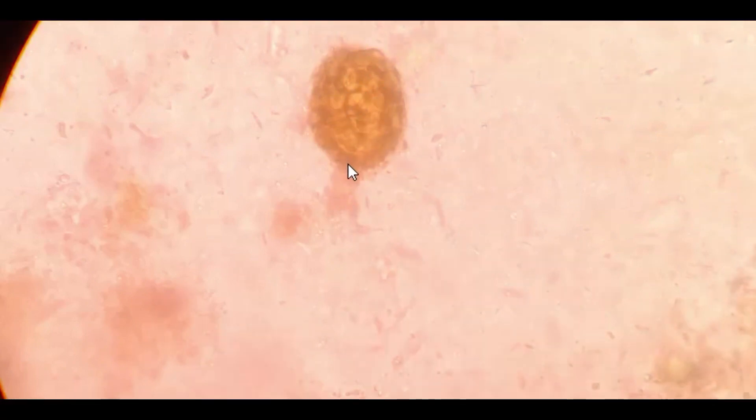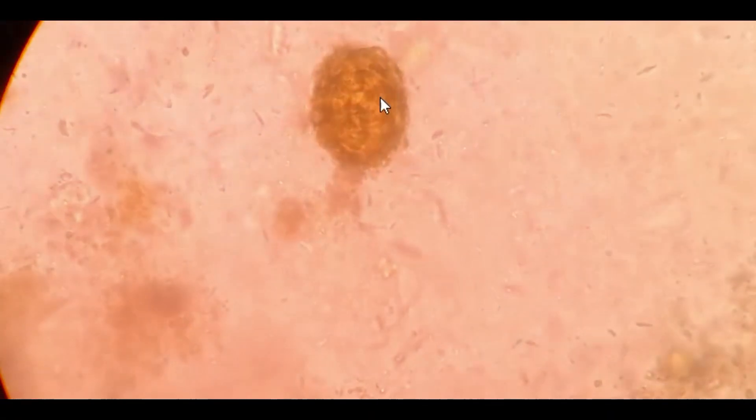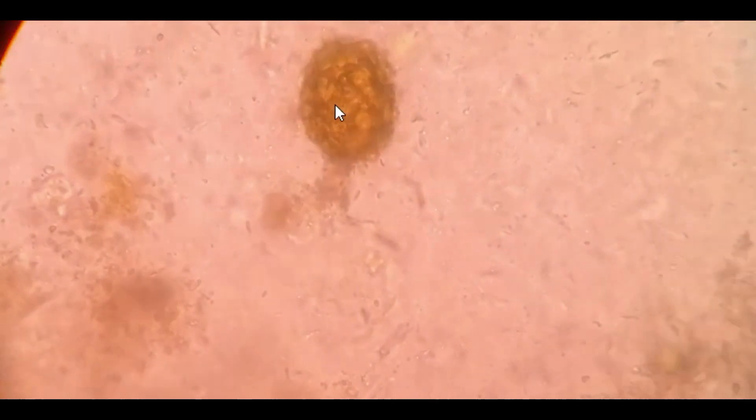So watch this carefully. We will see a movement inside this egg. Wow! What a beautiful movement inside this. Isn't it?